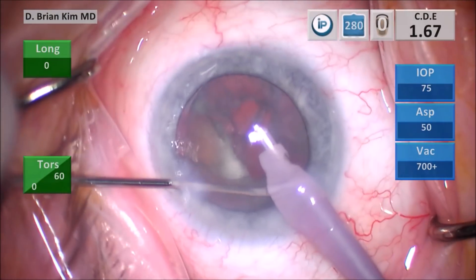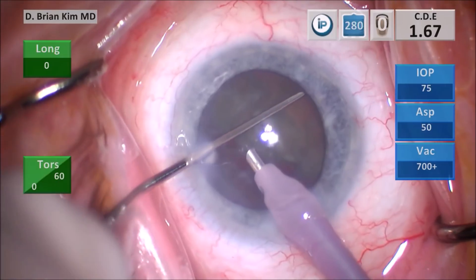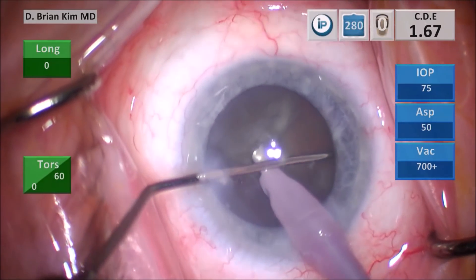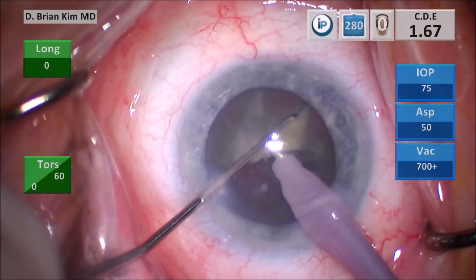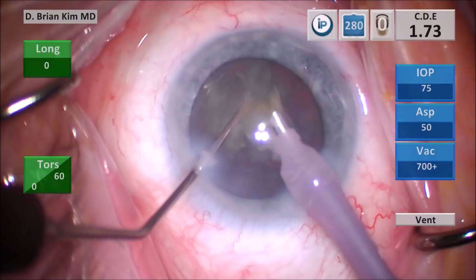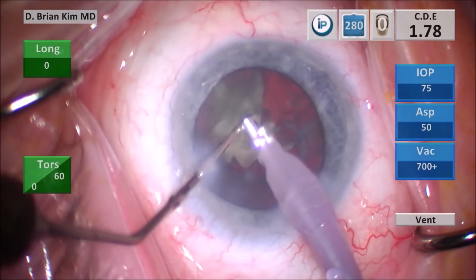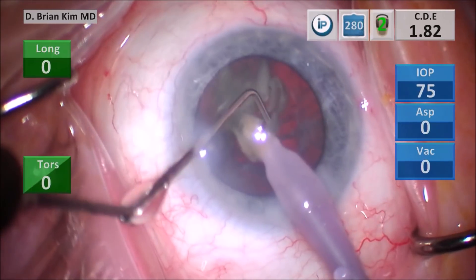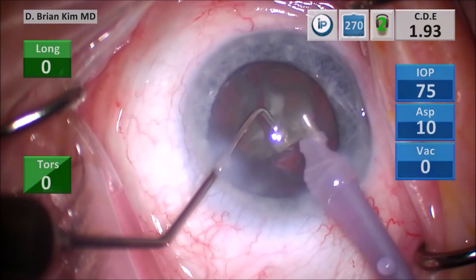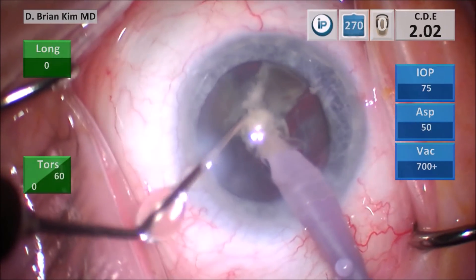I'm going to rotate the hemi-nucleus in front of me, and then place the chopper again — pronating my hand, sliding it under the anterior capsule to make sure I don't snag it, and then supinating it to the proper position. I'm going to place the phaco tip deep in the capsular bag. This allows the forces to completely crush the densest part of the lens. I then perform the same maneuver by placing the chopper out to the equator and bringing the chopper towards the center, crushing that piece. I initiate a little bit of vacuum to get the piece out of the bag, but once I do, I turn off the vacuum. Once I direct the lens between the two instruments, I crush it, then pulse with ultrasonic energy and vacuum. By using ultrasonic energy and vacuum sparingly, I think it does enhance your safety.